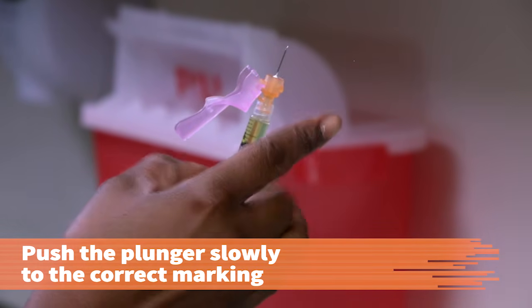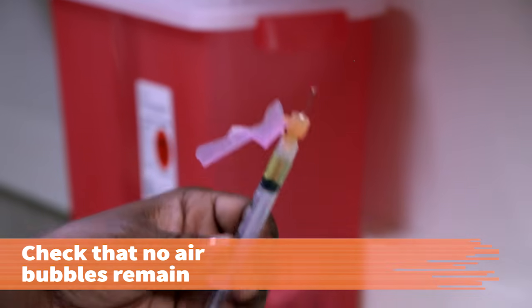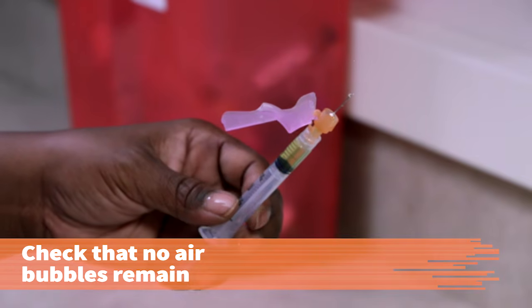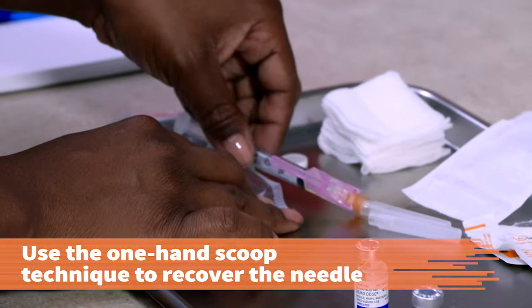Push the plunger slowly to the correct calibration marking for the ordered dose. Double-check that no air bubbles remain in the syringe and that the right dose was measured. Use the one-hand scoop technique to recover the needle.